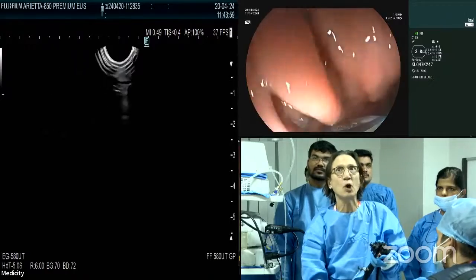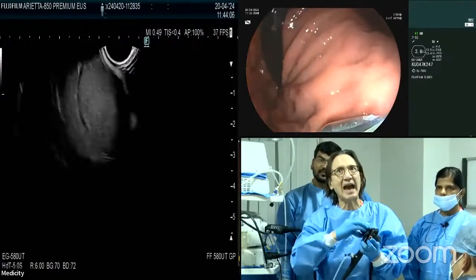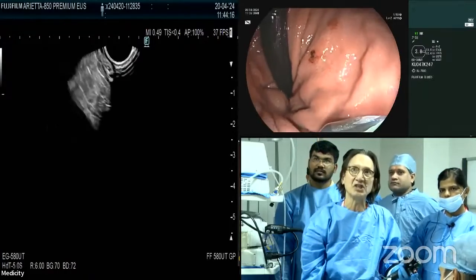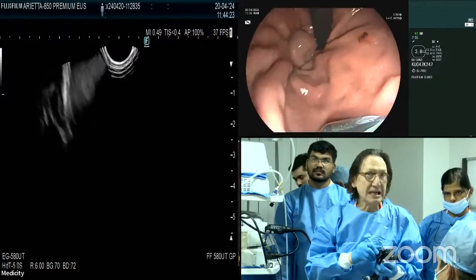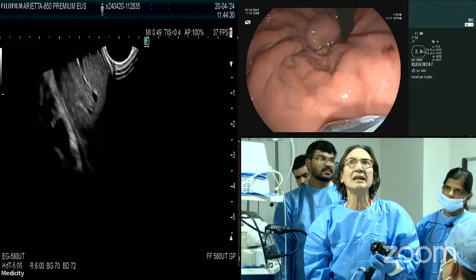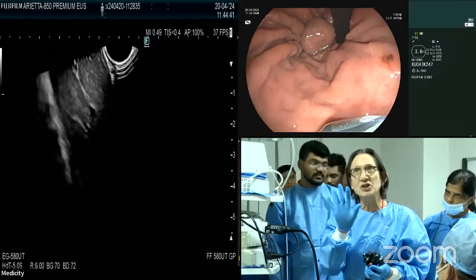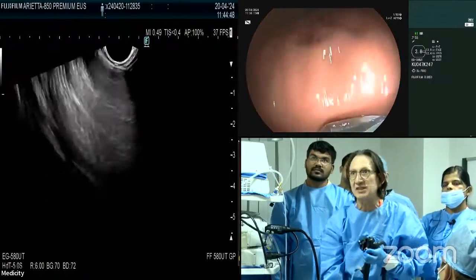One of the things you can do with the echo endoscope is go into retroflexion and see the fundus. You have to insufflate a lot of gas, but you can see here — at the very top next to the scope — there are large gastric fundal varices. You should look for any stigmata of recent bleeding: red wale signs, white nipple signs. This patient has not bled from varices before, so this is prophylactic — but we have good data to justify prophylactic treatment of large gastric fundal varices.